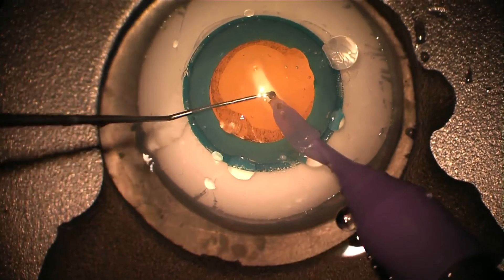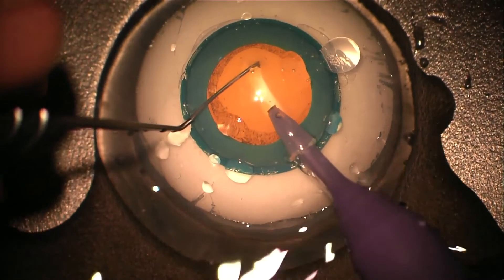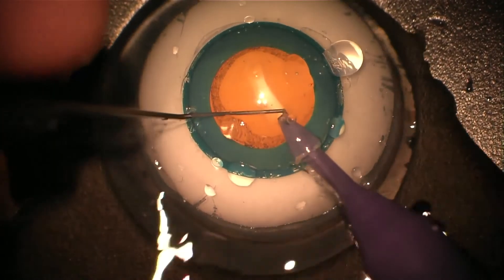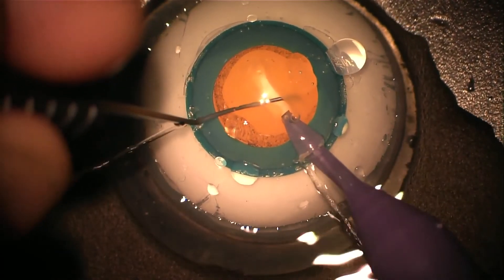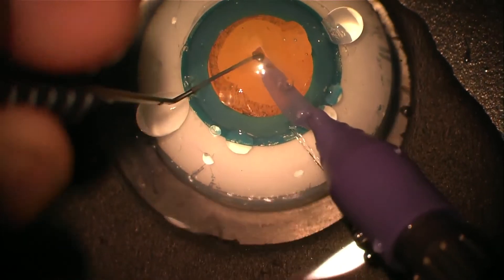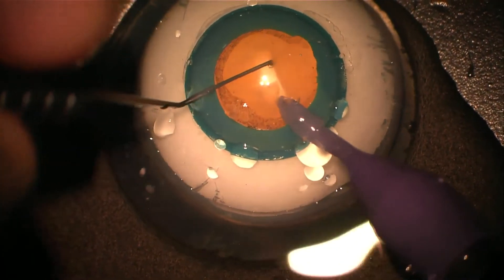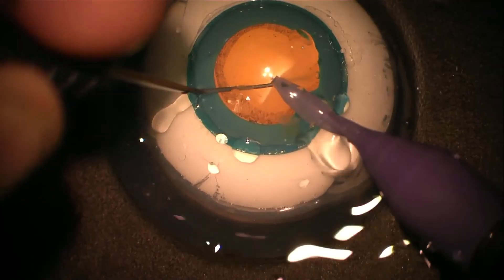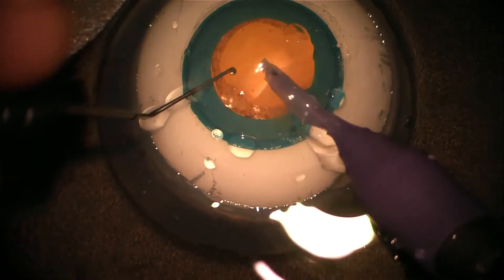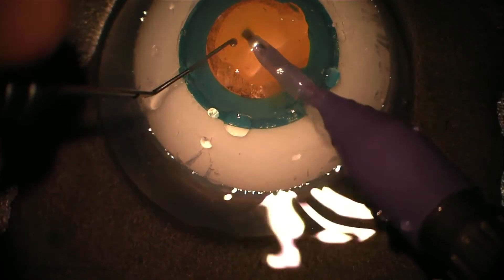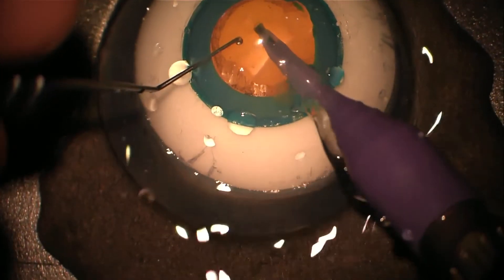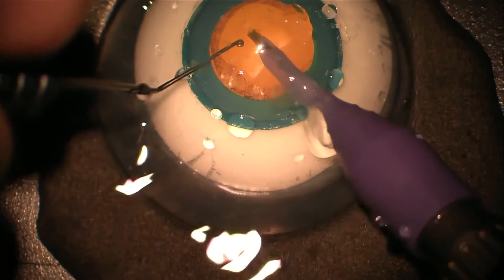Again second instrument being introduced, this time a mushroom manipulator, and using it to rotate the lens. You can see how it's relatively soft but it still rotates and it gets the trainees to practice in a different environment what they've learned on the IC.